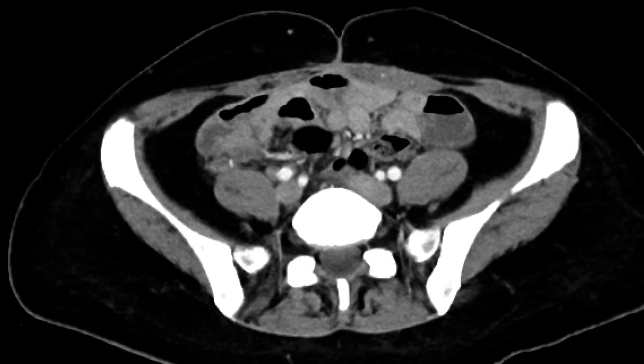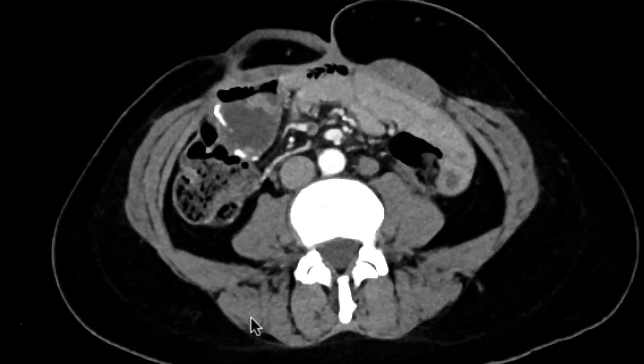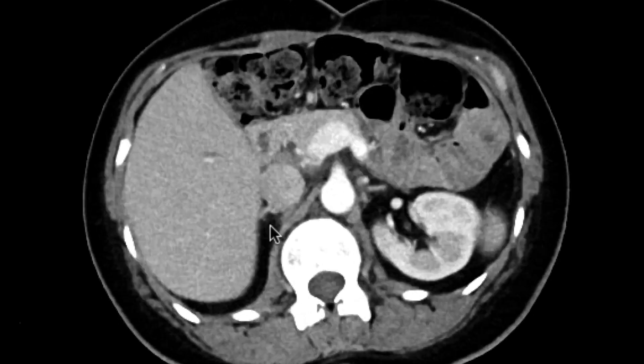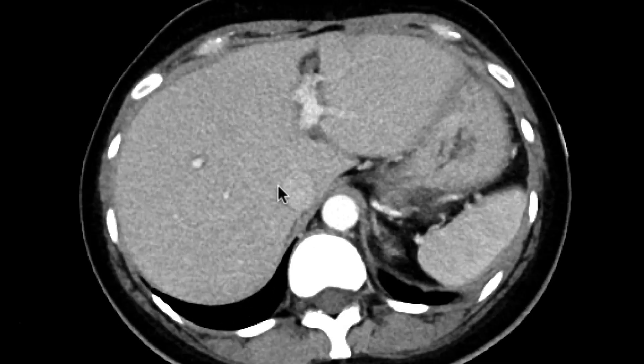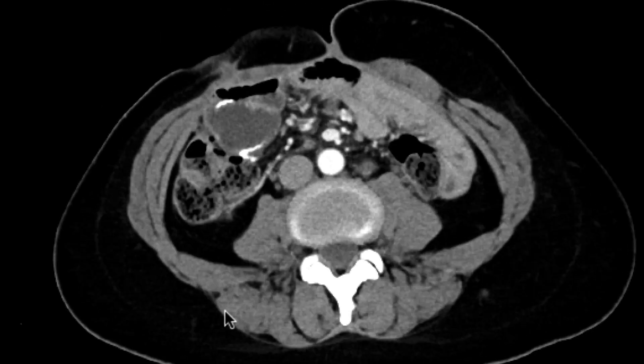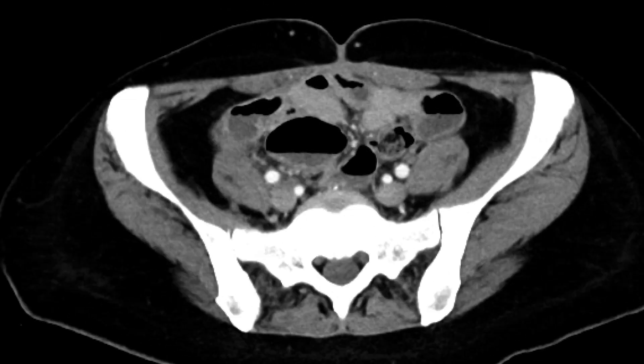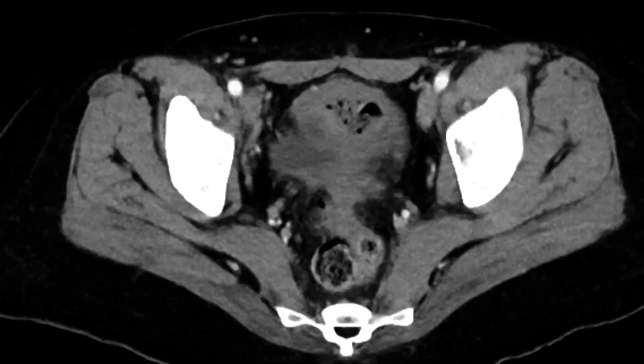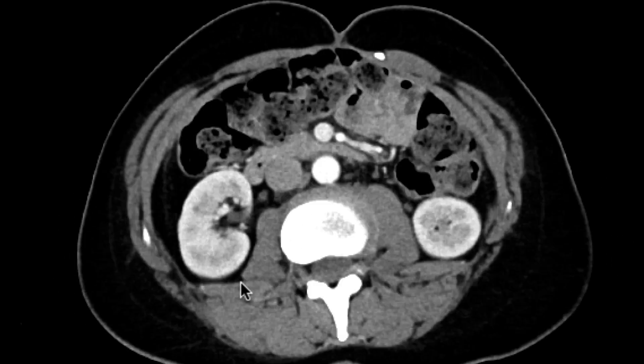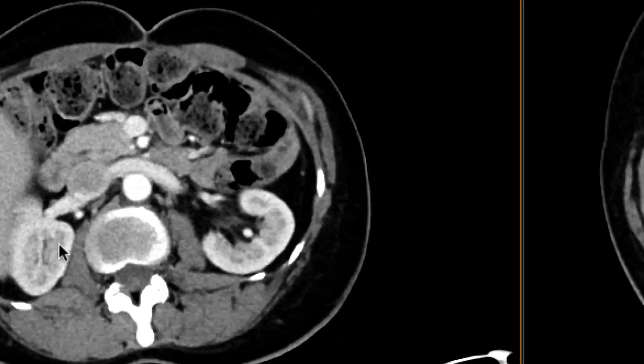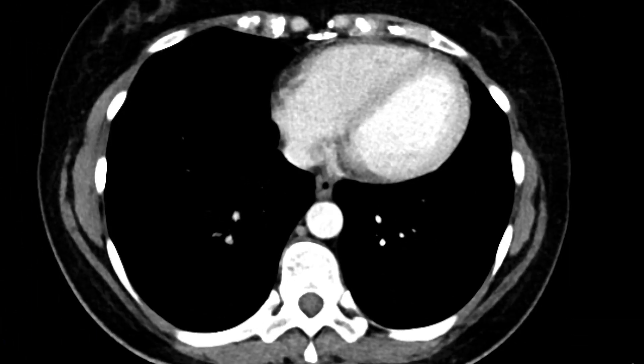As we scroll upwards again, you can go through organ by organ, do your checklist as you go through this, and you'll see that at first it's quite difficult to pick up on the abnormality over here.